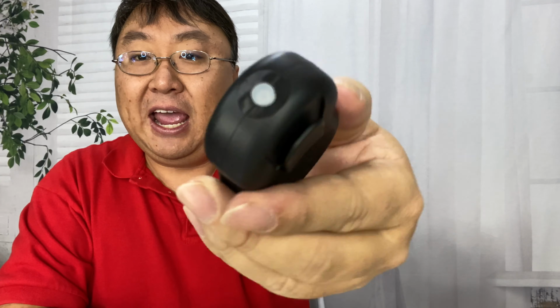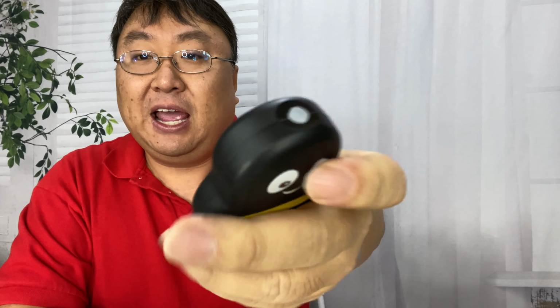You might remember that, and she actually was driving, she's a doctor, and she was driving home one day on a rough road or something, and the steering wheel was vibrating for a while, and when she took her hands off the steering wheel, she realized that they were kind of numb. And so that vibration creates some loss of sensitivity in your skin, and so she designed this little buzz bee, and I think it just kind of buzzes, and you hold it up to your skin where you're going to do that shot, and it kind of numbs it.